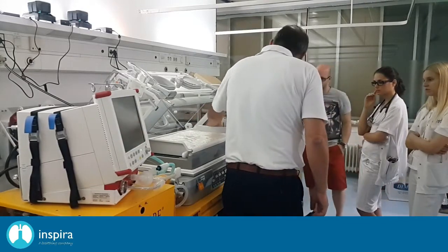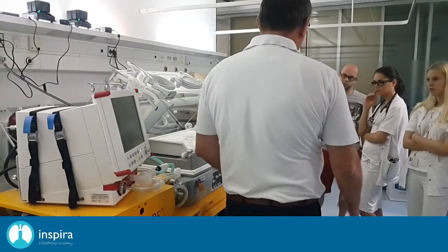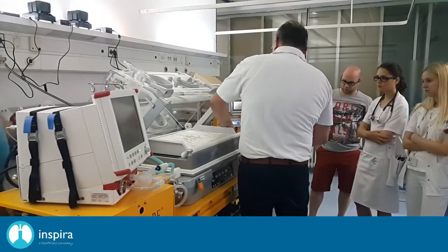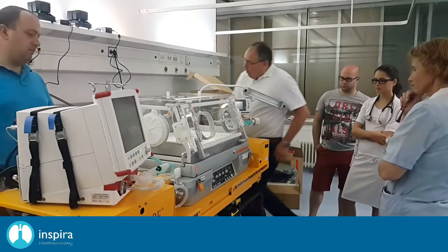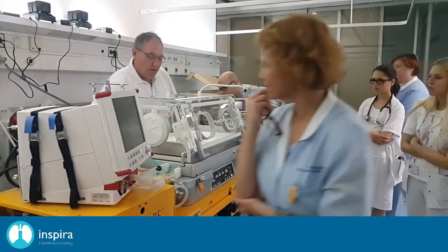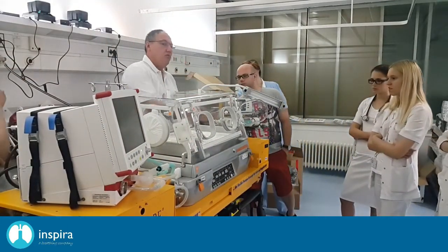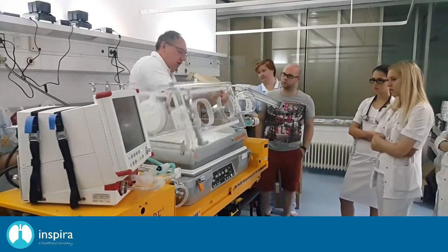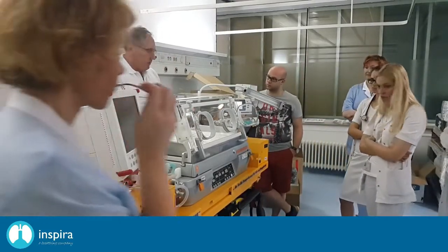In terms of emergency at the baby, if you want to go from both sides directly to the baby in case of reanimation or whatever, you have an emergency access to the hood. If the hood is like this, you can take away the whole hood by pulling these things here, okay, on both sides. And now I can open the hood, and it's only 2.5 kilos weight, and then I can take it away, okay? So it's only a possibility for really emergency situation, okay?